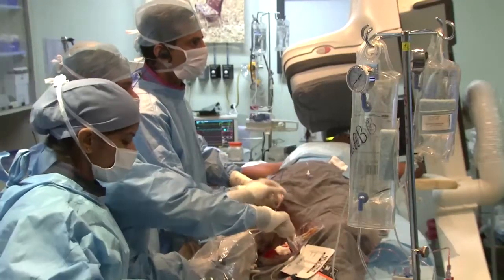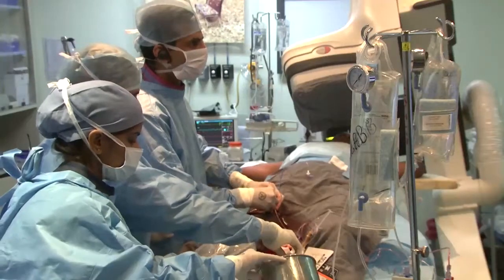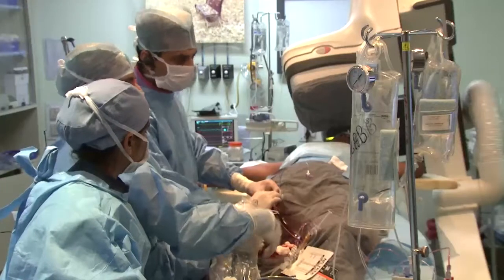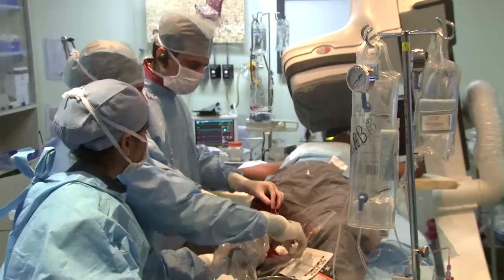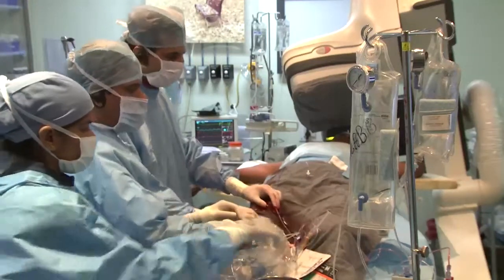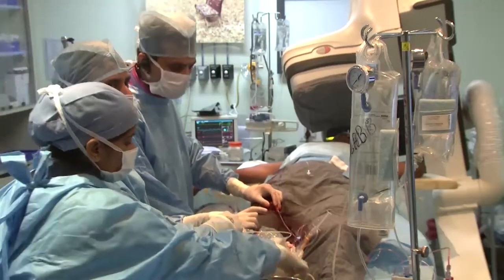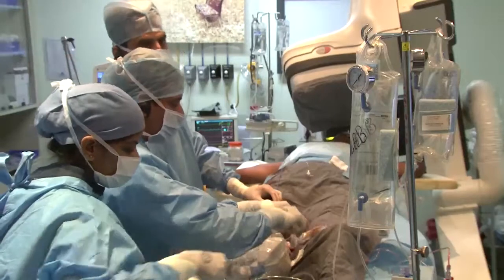So the moderators, do you think that, Dr. Vijayan, for example, would you have gone for kissing, or would you just leave the diagonal like this? Yeah, I think that's a fair point. There was pinching as usual, but flow seemed to be okay.